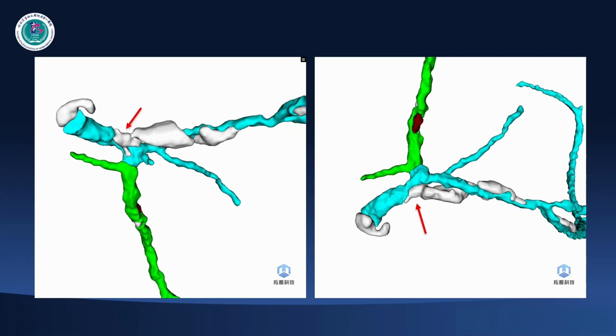This time we delete the brown soft tissue. We can see clearly the distribution of the calcified lesion at the left main, and the calcified lesion protruding a little bit to the ostium of the circumflex. After we delete the brown soft tissue, we can see the proximal LAD should be deep calcification.